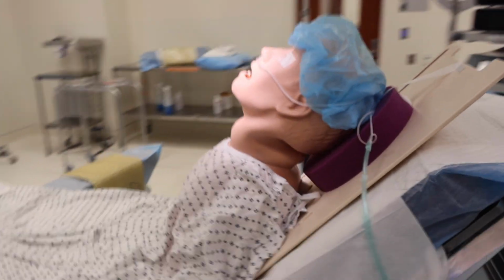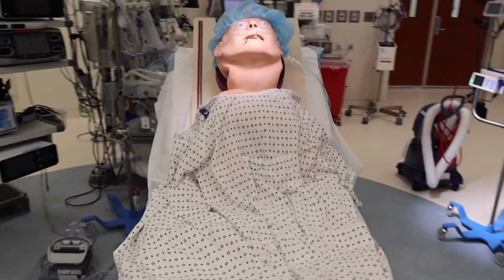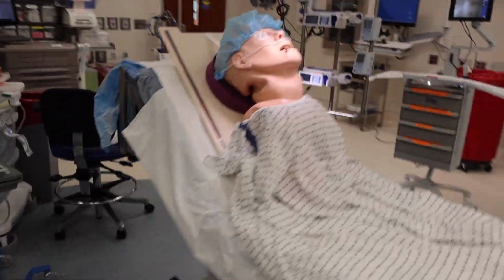Using the UNC Resident Awake Fiber Optic Intubation Teaching Guidance, we'll walk through a standardized time-based protocol. Before you begin, alert the anesthesia technician that an awake fiber optic intubation is planned. Position the patient sitting upright with the head of the bed up. Ensure standard monitors and nasal cannula are applied.